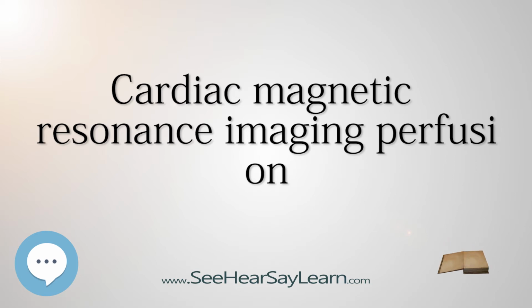Patients with severe renal dysfunction, as the gadolinium contrast agent poses a very small risk of causing nephrogenic systemic fibrosis, NSF, and is therefore contraindicated when the eGFR is less than 30. Patients who have heart block on their ECG before the test, as the adenosine may make this worse. Patients with severe claustrophobia, as the MRI scanner is enclosed.